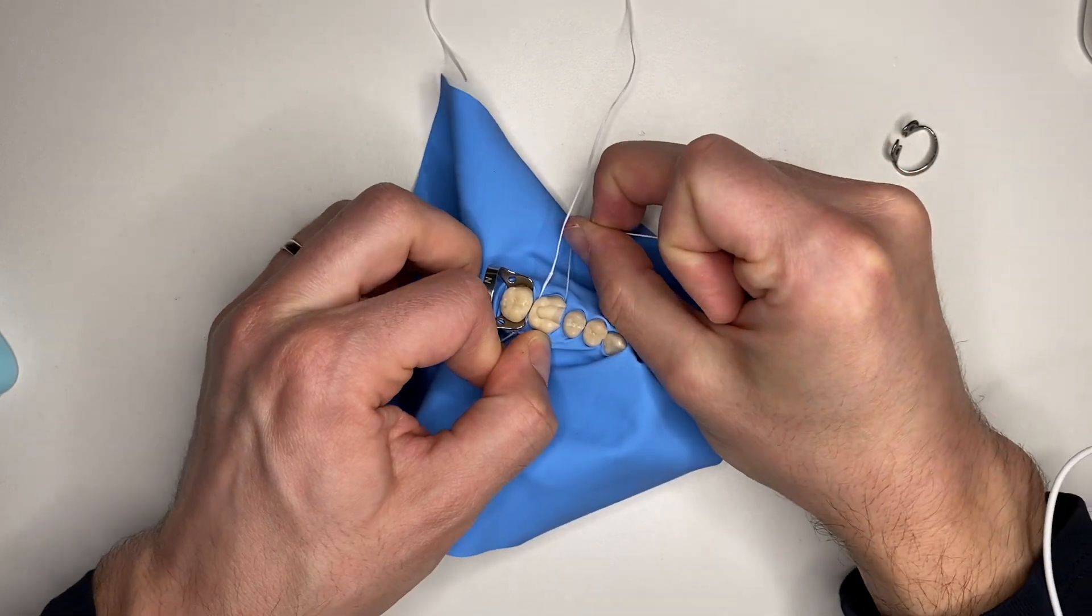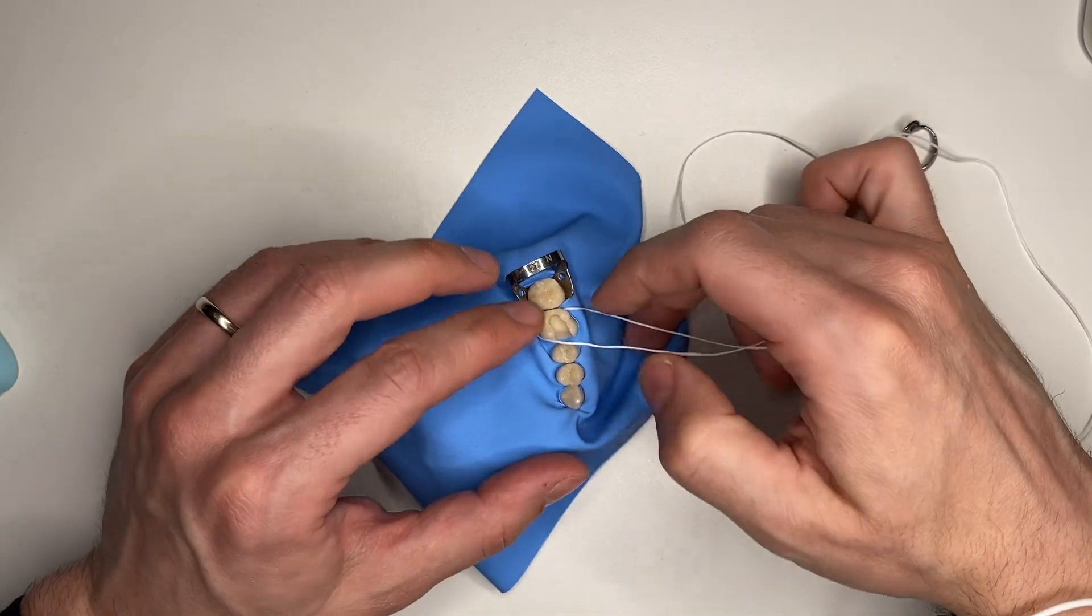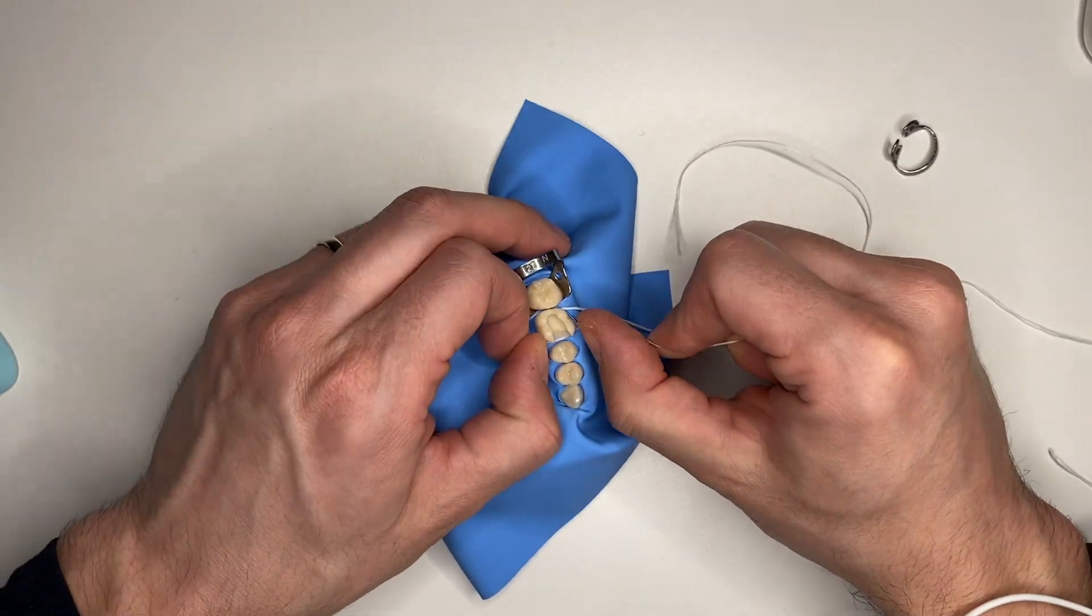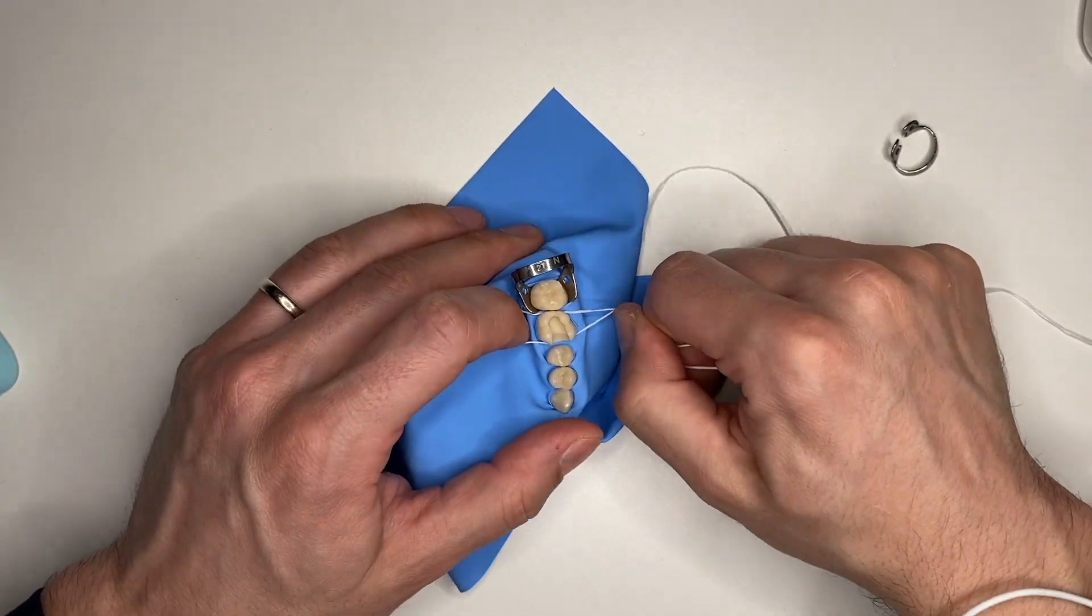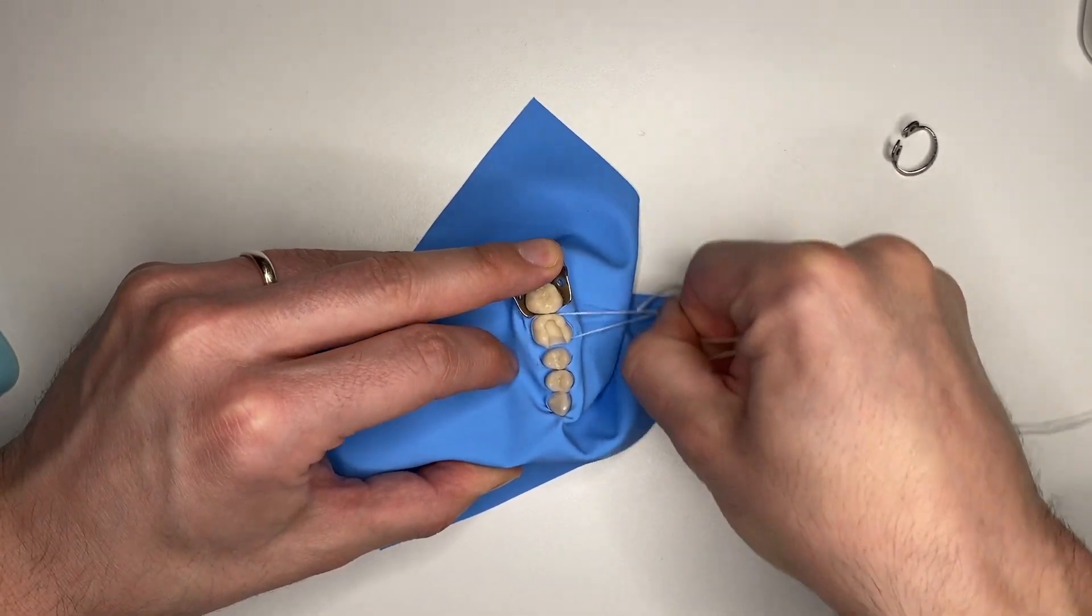As you can see, it invaginates the rubber dam rapidly. You can use a probe to do this.